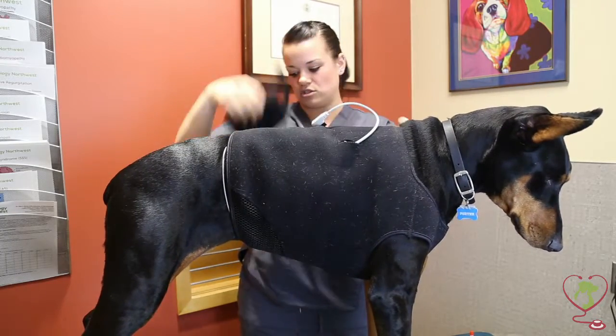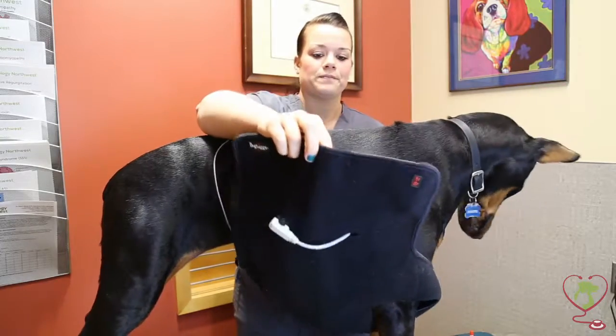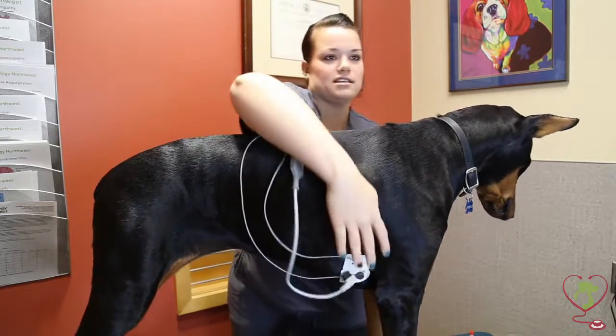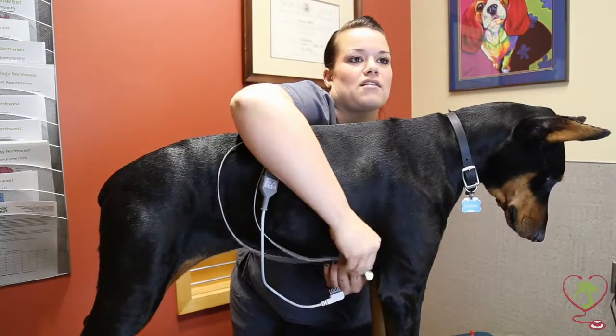Remove your pouch, and then remove the vest. The wires easily snap off, so you can just snap those off.